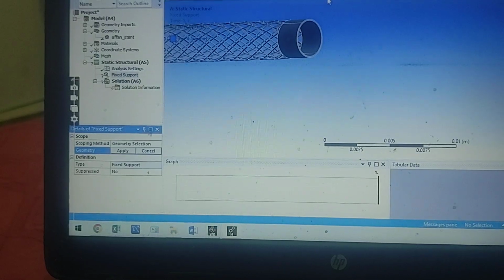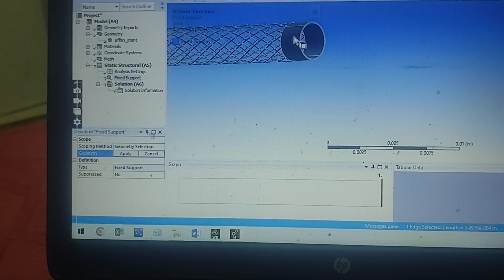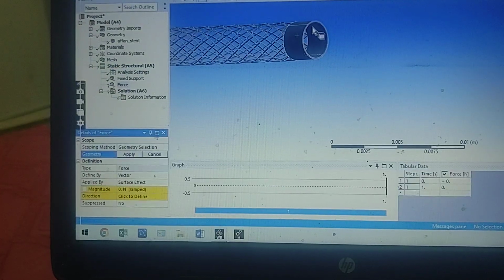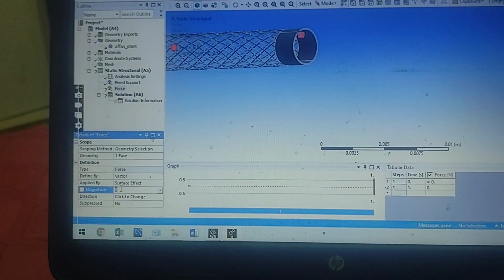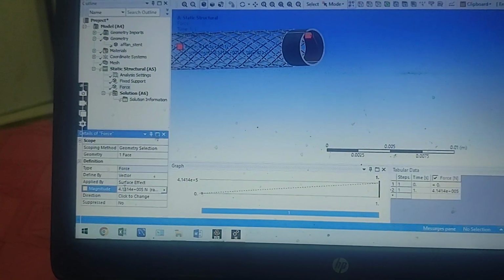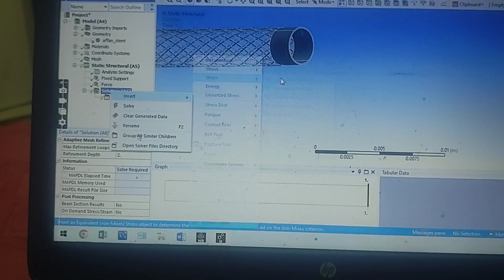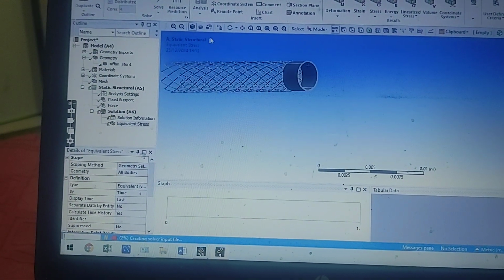ANSYS does not allow me. Go to mode, single select. Now you can select any face, this face for fixed support, and then go to Force. You can apply force on the outer surface, and give 441 Newton. It's up to you based on your blood flow and blood circulation. Then for stress, click on the Solve button, so it will solve for you.